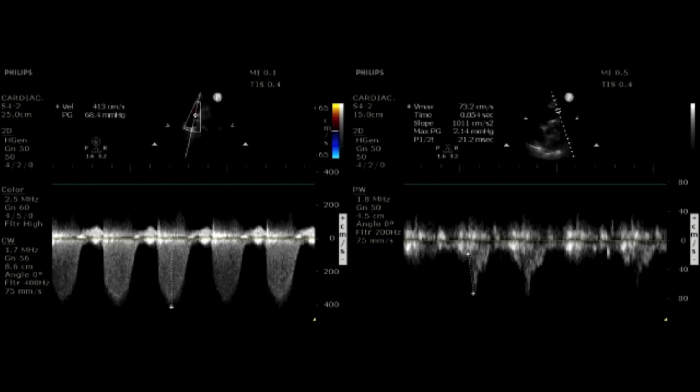The one place where you would find a little bit more of a tie break is in patients that have right ventricular hypertrophy. And you can tell that by looking at the trabeculations in the right ventricle. If they're in the moderate or band thickness, if all of that looks really prominent, and the wall thickness, which is typically measured in the subcostal view, is more than 7 millimeters, then you think about right ventricular hypertrophy being present, and that's more of a chronic process.